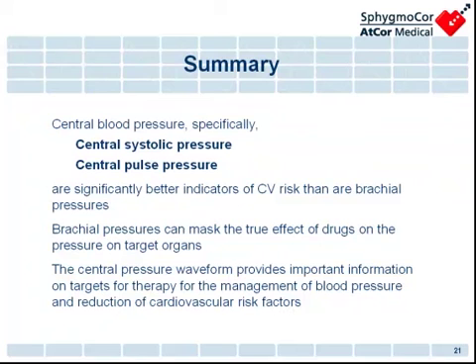So central pressure waveforms provide important information on targets for therapy, for the management of blood pressure, and reduction of cardiovascular risk. And I think that's very informative. Again, it's a non-invasive way to monitor our patients. Very simple, but very elegant to show improvement. Or if we're not improving, we can change our algorithm and our management. So I'll stop at this point and turn it over to Susan for the third part of the puzzle, and then we'll come back up for Q&A in a little bit.